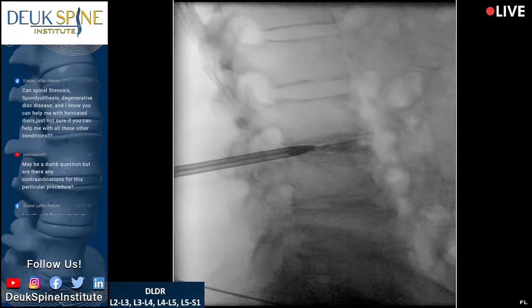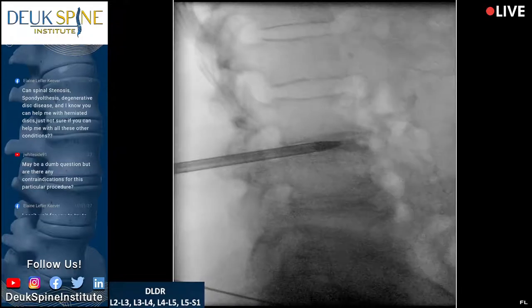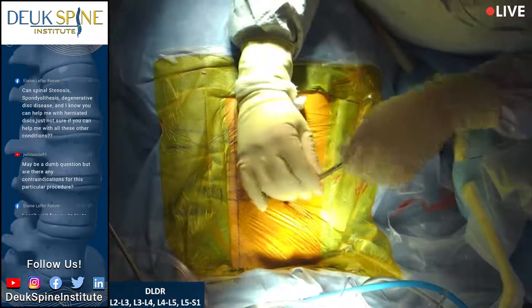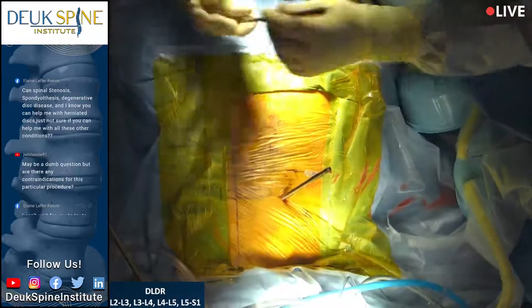All right, very good. So we are now inside the L2-3 disc, and we're gonna bring our tube down. And let me just show our audience. The whole surgery is done through this little tube, it looks like a shake straw, that's made out of stainless surgical steel. Of course, all of this stuff is made in Germany, but it's all FDA approved.